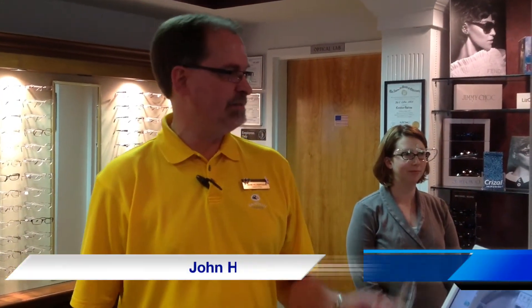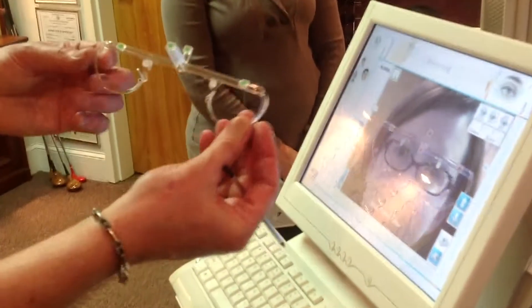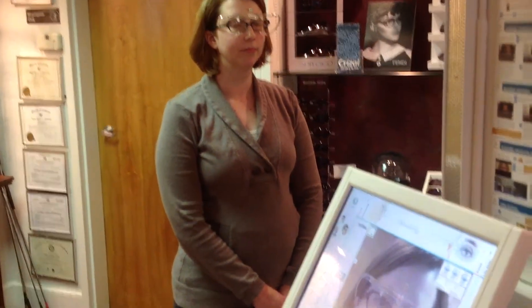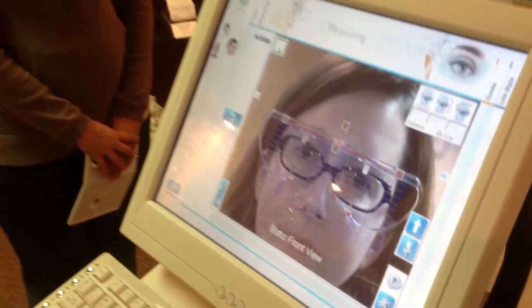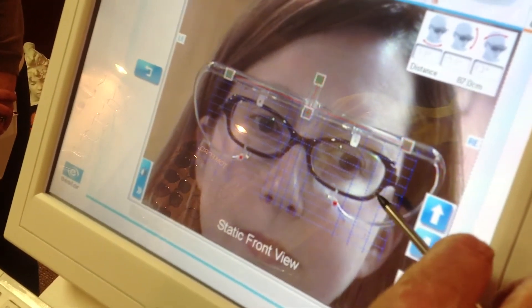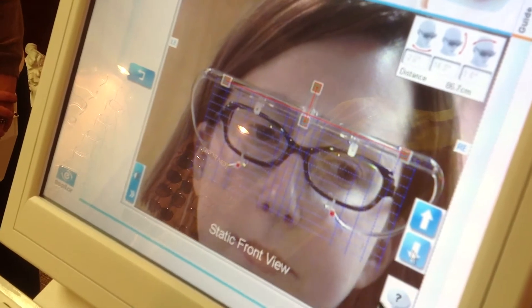Hi, I'm John. I'm a licensed optician here at Spectrum Eye Center. Today I'm going to demonstrate our new piece of equipment called the Visio Office. This is a pupilometer that we use to measure the distance between your pupils to provide you with glasses. Today we're going to use this state-of-the-art equipment using a sensor attached to Jackie's frame along with the computer system. This will scan her glasses on her face giving us the pupillary distance, the vertex distance, and the panoscopic tilt of the glasses.